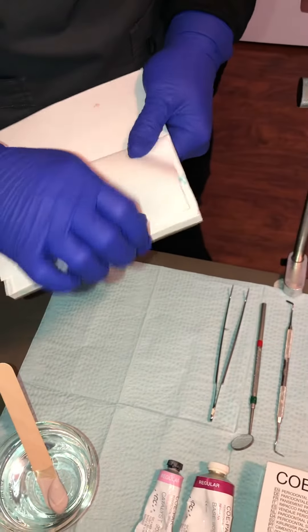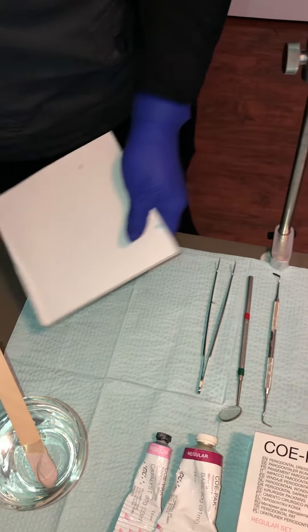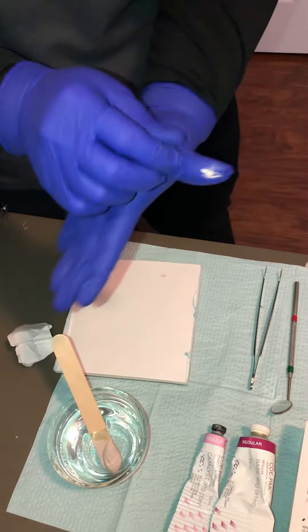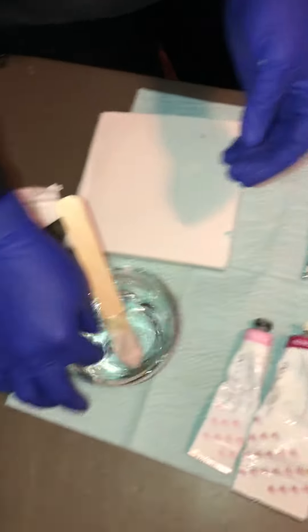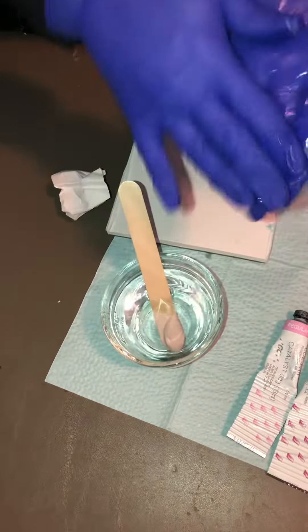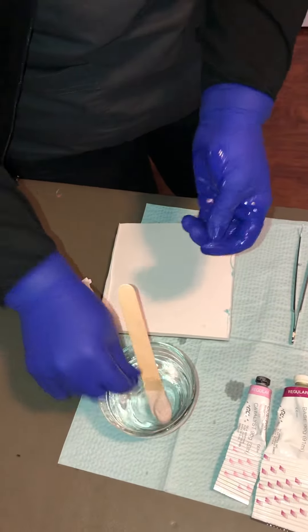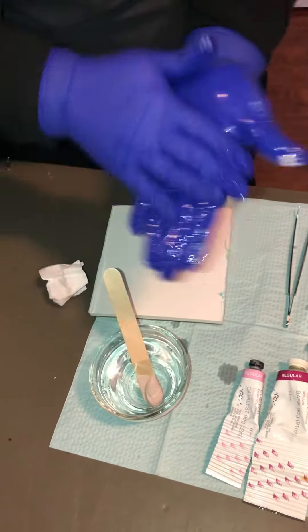You have to make sure your gloves are wet, otherwise it will stick to anything that's dry — it's already on my glove. So get your fingers wet, get your gloves wet, because once this sets a little more you're going to roll it into a little ball.